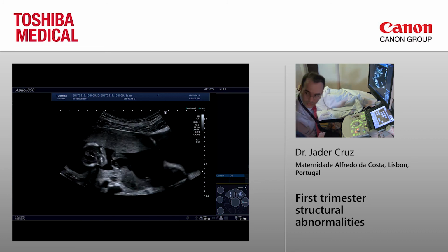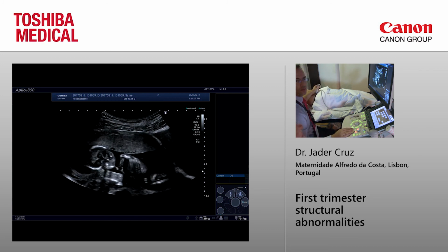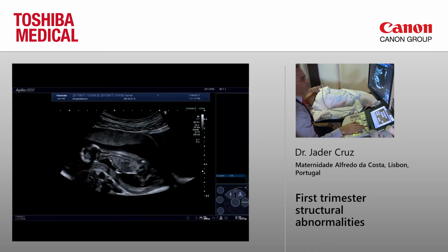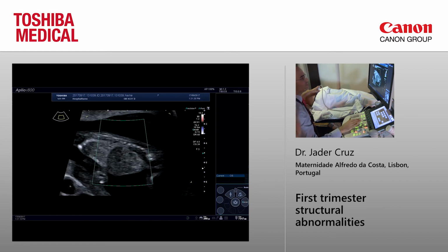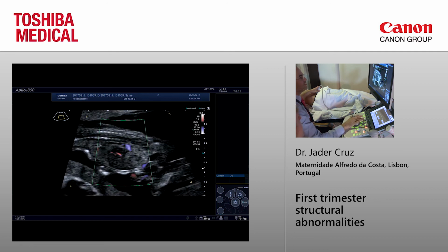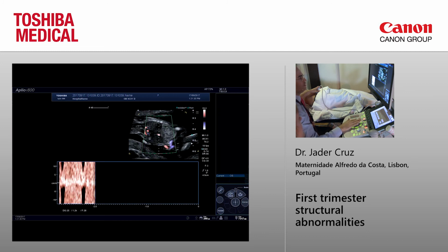You're doing a brilliant job, but would you be able to show us ductus venosus and tricuspid regurgitation, please? Ductus venosus and tricuspid regurgitation. Okay. I hope I can show you tricuspid regurgitation, but the ductus venosus, yes. There you have it. Yes, ductus venosus. You have the aliasing there, and of course the baby is moving. And now I pressed the wrong button.